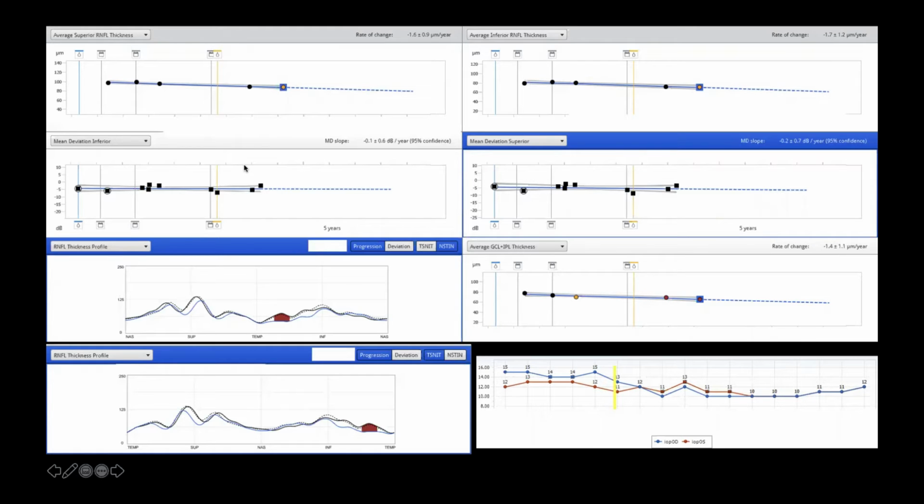So when we start to look at the case, we can also take into the picture our clinical exam findings. And so I've also included his IOP findings down in the corner. And we know that he's had these 3 Drance hemorrhages over time. At one point, we decided that it made sense to actually add the timolol, and we can see that that was done here with this little yellow line, and we can see that the right eye pressure was a little bit elevated prior to that point in time.